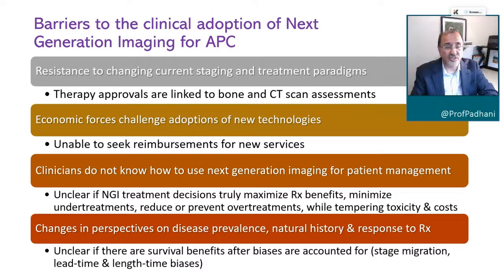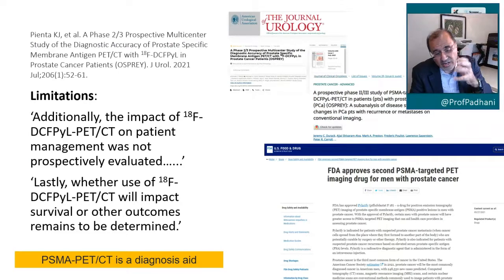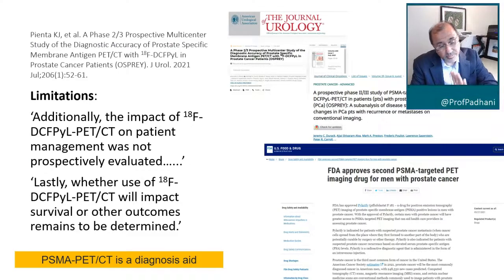So these are real issues that we as radiologists need to get a hang of. Now, the question really is, do we need to show improvements in management? Well, as far as the regulator is concerned, they say we do not need to do this.